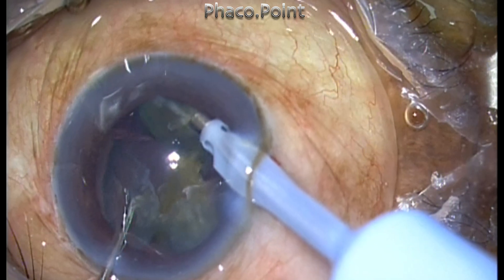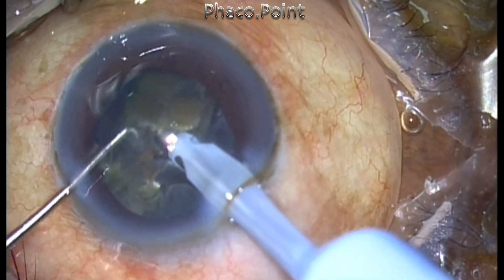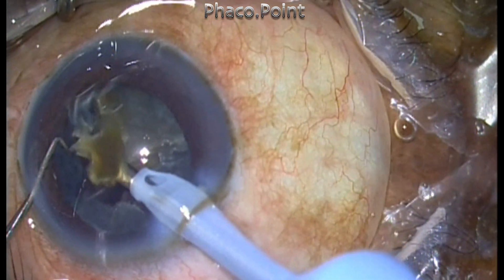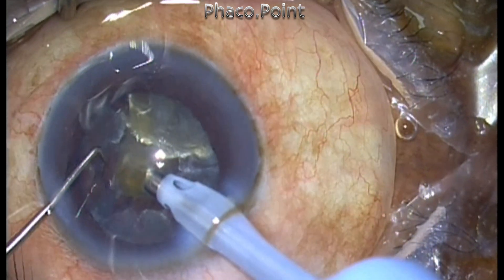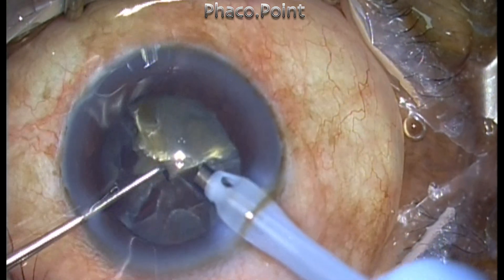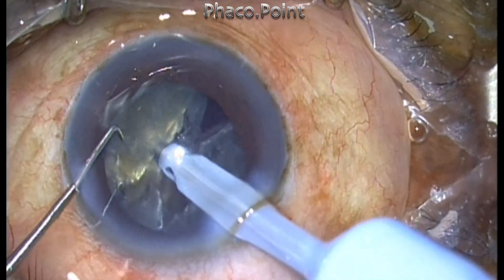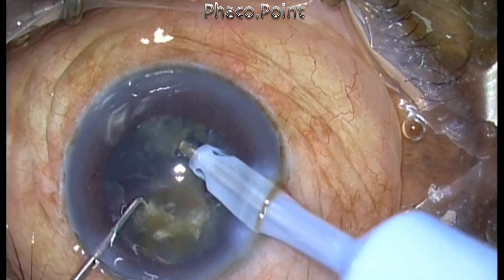Creating smaller fragments gives you greater control over phacoemulsification. You won't have large pieces getting prolapsed and completely obscuring the view. Making these smaller fragments ensures that the view of the remaining part of the nucleus is extremely clear, and you know exactly what you're doing at every step and stage of the procedure.